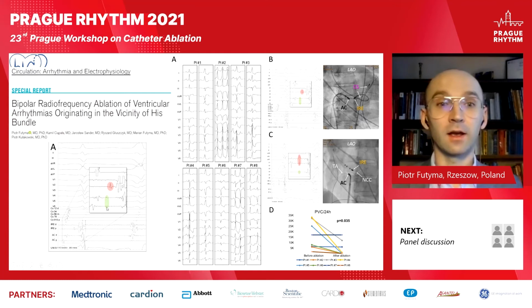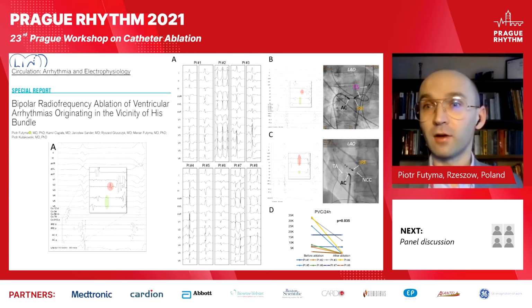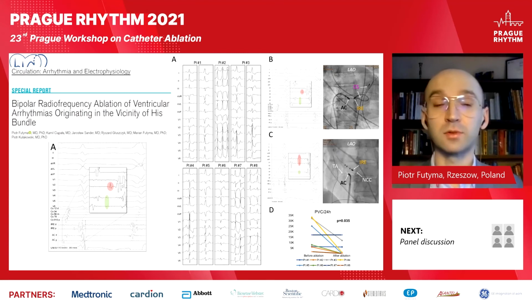Despite this, radiofrequency ablation in this particular patient was successful, and there was no complication, no persistent AV block in this study. So if we uptitrate our energies very, very gradually, we can deliver a safe lesion even in close proximity of fragile anatomical structures.